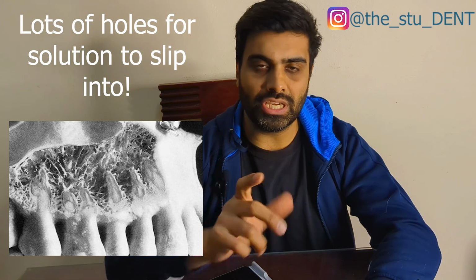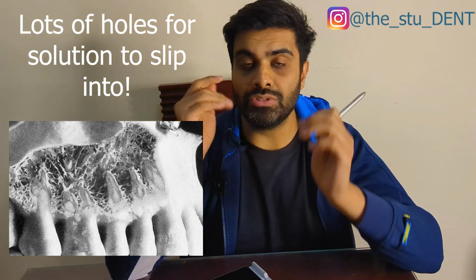For infiltration, we're going to be targeting the buccal side of the maxillary for today, and then the palatal side. And within that, due to the way the bone within the maxilla is actually quite porous, it means that when we inject through, we typically get through to the pulp as well. So we're hitting the regions around the root, which means that the pulp is actually also anesthetized at the same time.